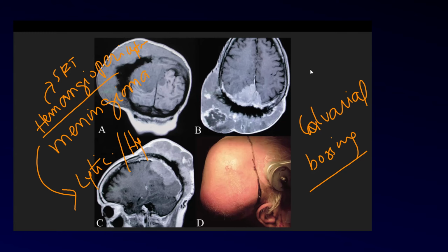So can lysis happen in meningiomas as well? What if I say this patient is a biopsy-proven meningioma, but they still have an osteolytic appearance on the bone? It is possible for long-standing meningiomas, where commonly I think we see it not on the calvarium but more on the skull base. It can have a lytic appearance as well. Yeah. So for hemangiopericytoma, the lesion is obviously going to look a lot more aggressive. There are going to be flow voids.